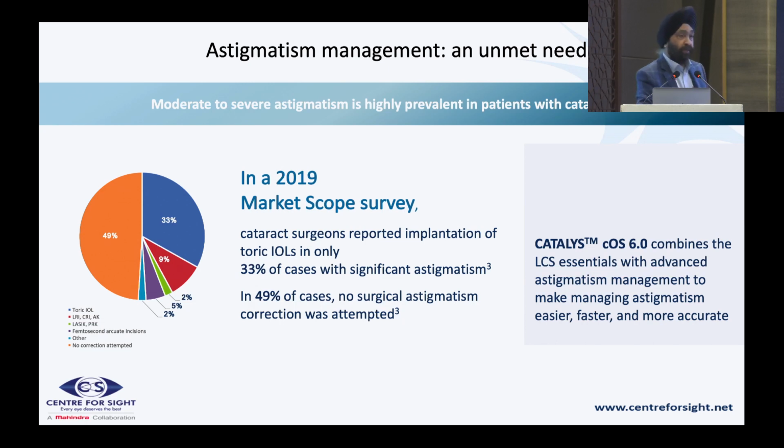When you're looking at the femtosecond laser people, obviously there is a slight contradiction in terms, because they are also manufacturers of IOLs at times and they want to sell more toric IOLs. So they have not concentrated much on astigmatism correction with the LRIs. However, the Catalys system has moved. That's a system I use, so I'll be talking about it. They have moved on to the Catalys.